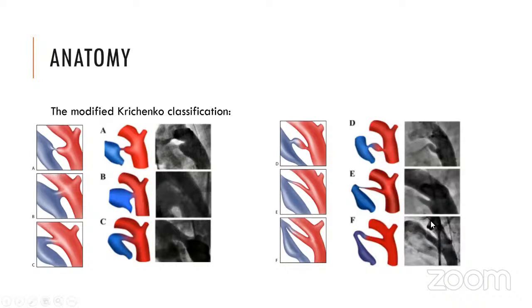Now there is the last subset called F type or fetal type ductus. This is usually found in premature infants that are presenting for catheter closure. It's usually wide, tortuous, and at times toward the pulmonary side, the ductus may angle and it may resemble a hockey stick. So, you can hear and see in all the presentations, accompanied by angiographic illustration as well.